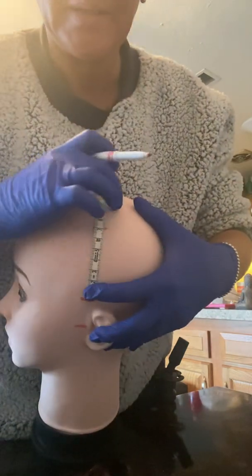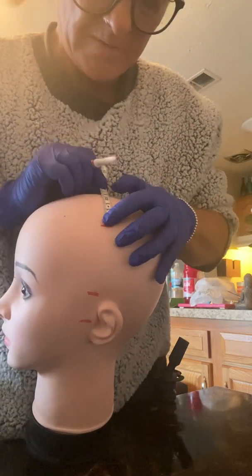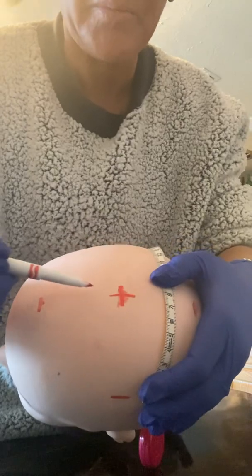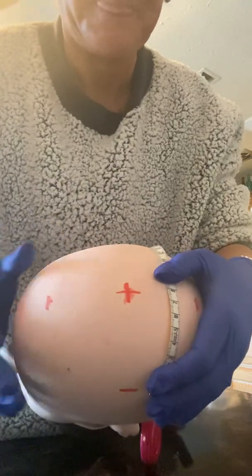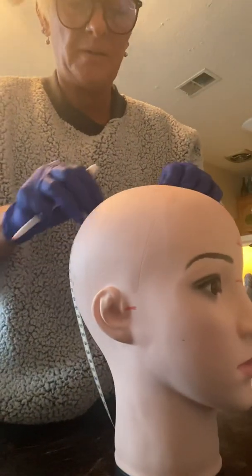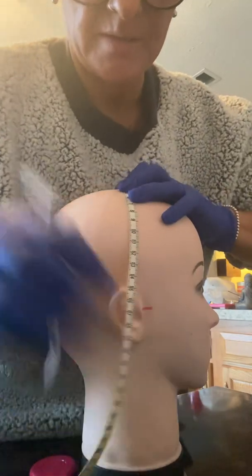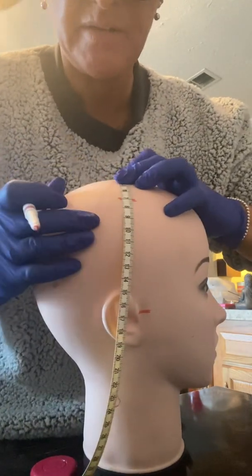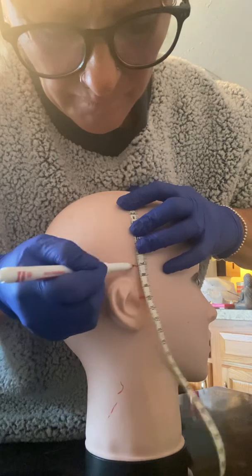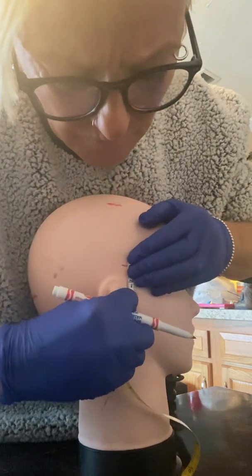So 7 cm is going to be our mark for C3. Then another 7, and we're going to make a mark crossing the existing CZ mark, so CZ now has an X. Then going to the right side, another 20% to get to C4 is 7. And another 20% is another 7, and then 3.5 to the right preauricular.